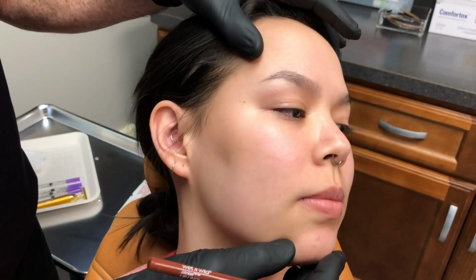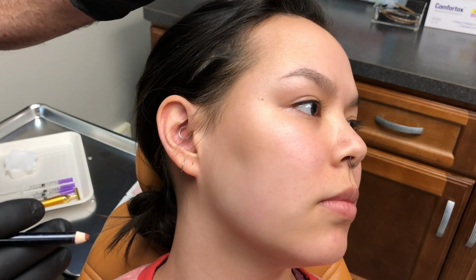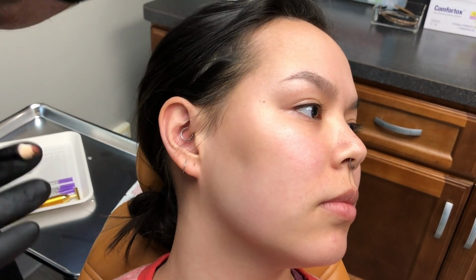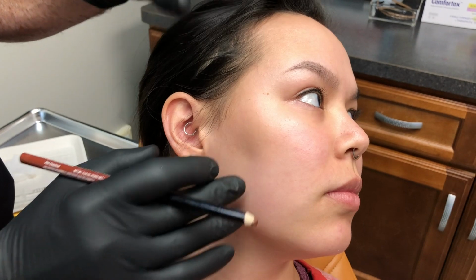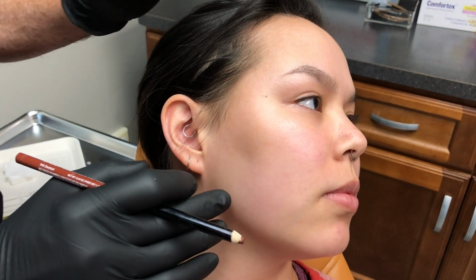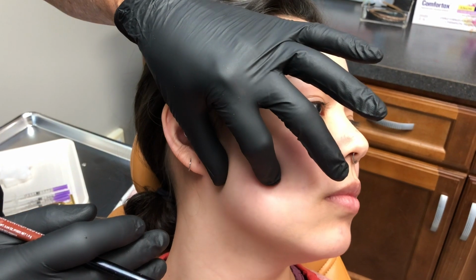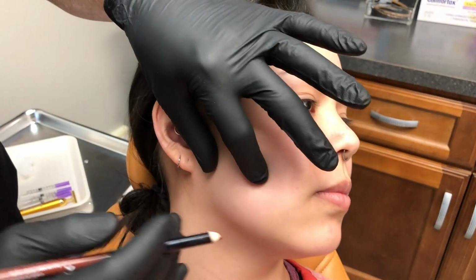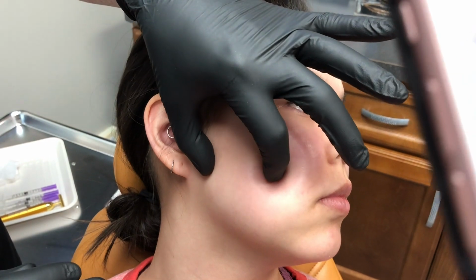I don't usually mark patients for you, but let's go ahead and give you a little anatomy lesson here to do these injections. By the way, every single dentist, nurse, physician, anybody giving Botox can do this, both for TMJ and headaches, which these muscles are very involved in for oral facial pain, and for masseter slimming as well. So here's her masseter muscle. Generally, bite your teeth together for me. Real hard, rock hard. I mean, literally rock hard.